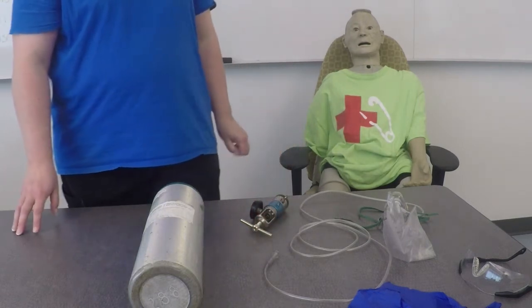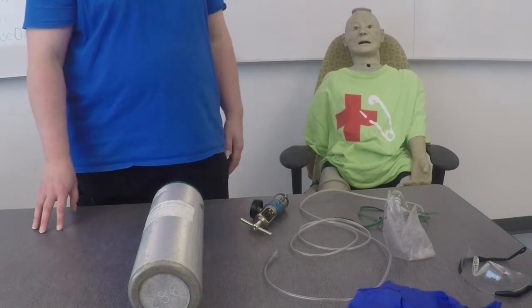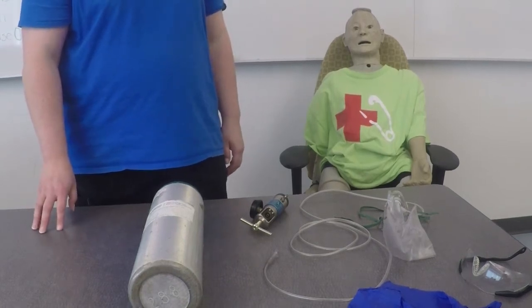I will serve as your trained assistant and will be interacting with you throughout this skill. I will correctly carry out your orders upon your direction. Do you have any questions? At this time, please take two minutes to check your equipment and prepare whatever you feel is necessary.